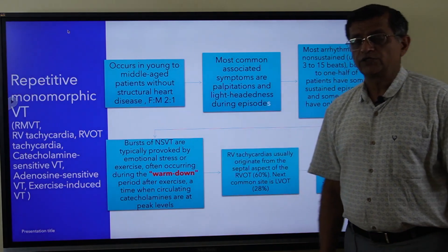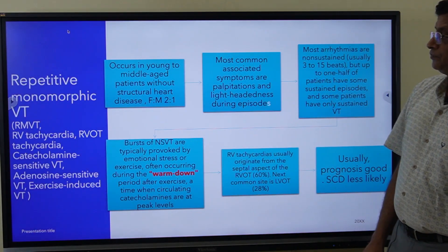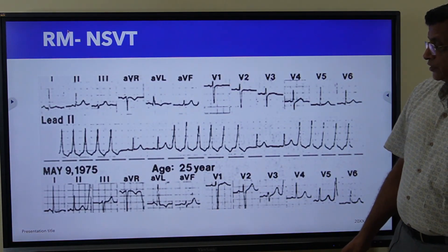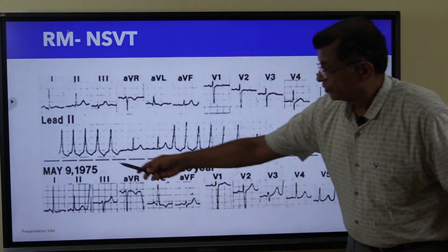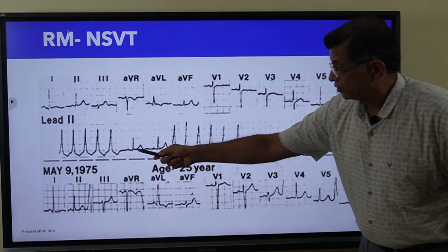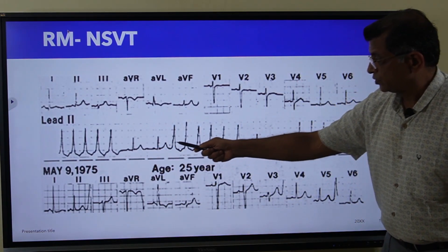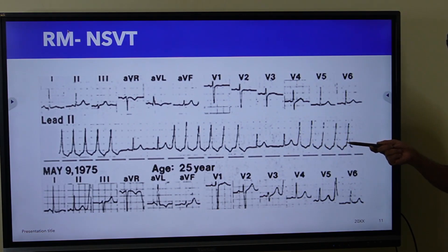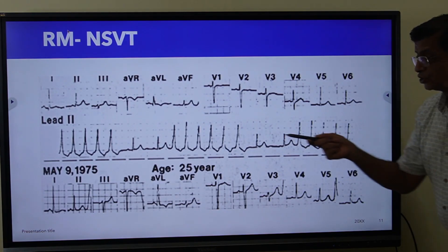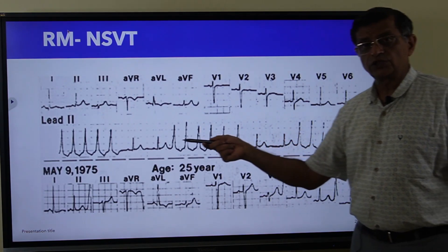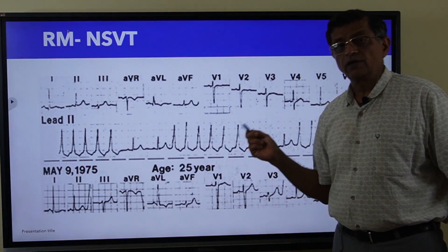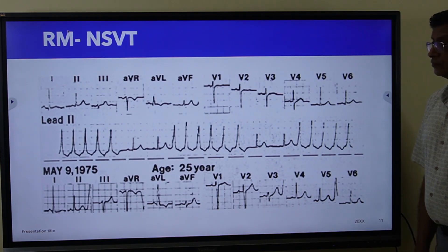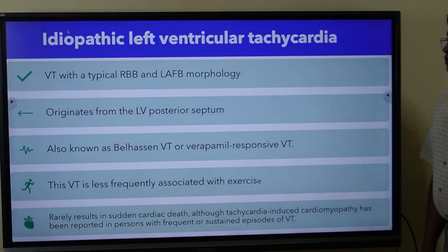This is an example ECG showing sinus rhythm, then suddenly NSVT, then back to sinus rhythm — bursts of non-sustained ventricular tachycardia.